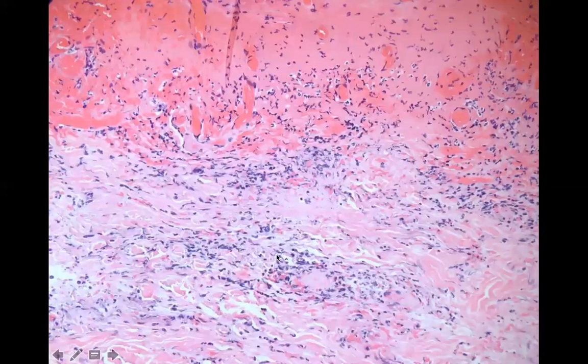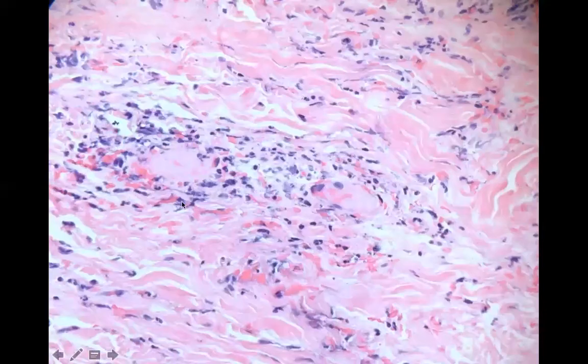Looking beneath a tick bite, one thing that you'll often see is fibrin in a vessel. So it looks like you get a vasculitis. But a vasculitis right under an ulcer, you always have to be suspicious. Is it a primary vasculitis or is it secondary? And then certainly with tick bites, you can see the vasculitis. See that?